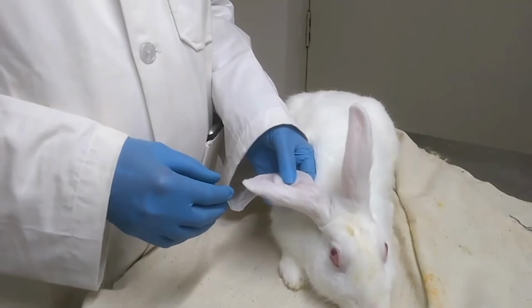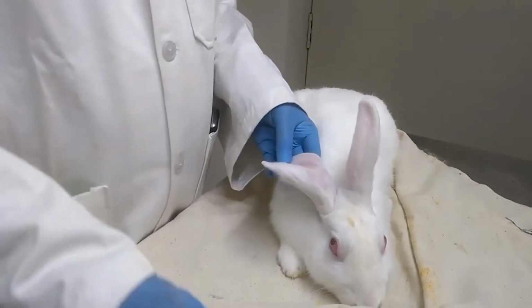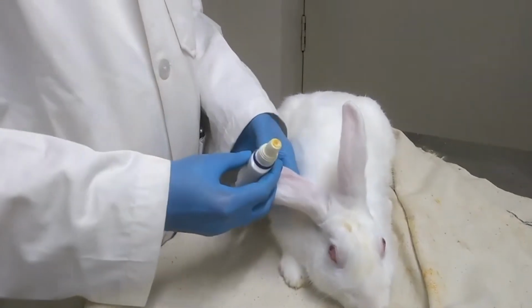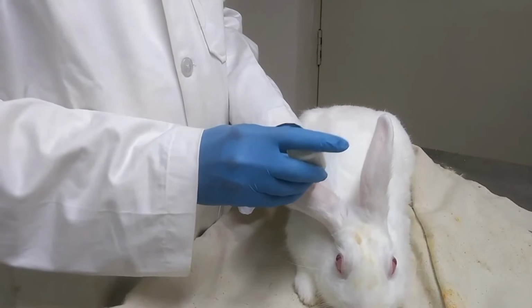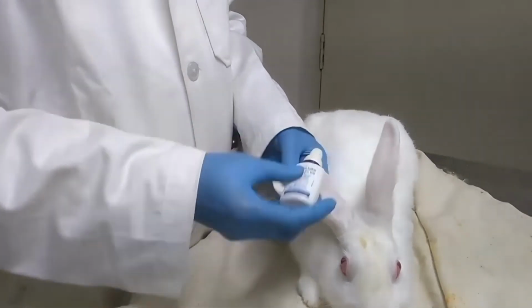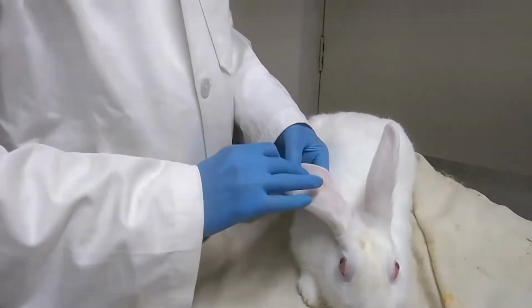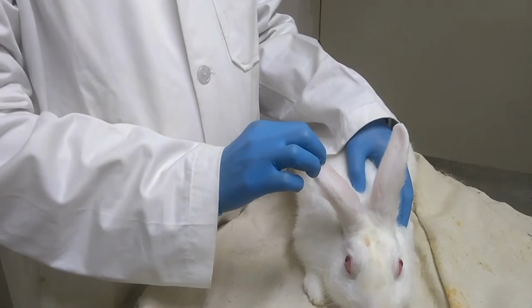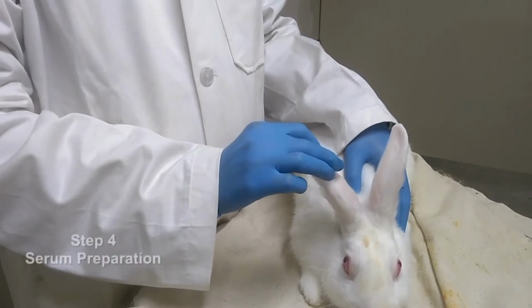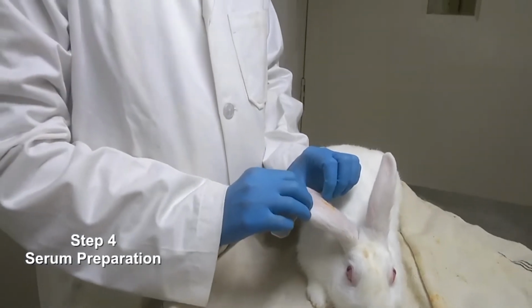So now I think the blood has stopped coming out, and now we apply some antibiotic. Here in this case it is betadine powder, so that there is no further infection or inflammation in the rabbit, and this also ensures that there is no erythema, and if there is any inflammation it will have some pain, so it will avoid that kind of pain also.